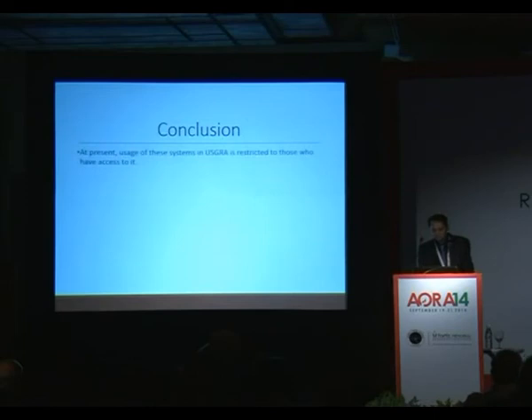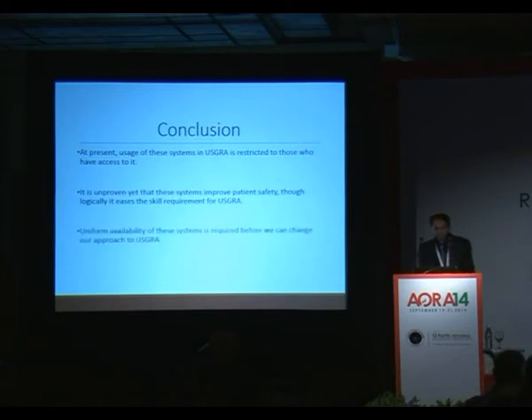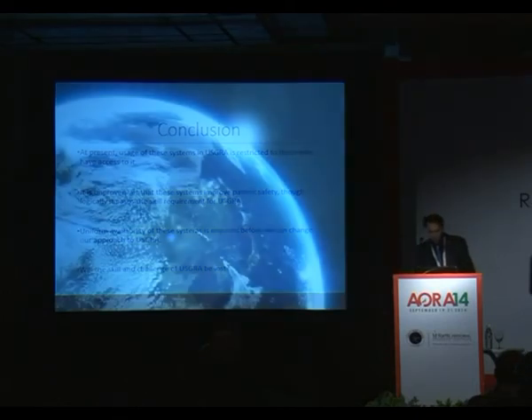In conclusion, it's restricted. Not many people have these machines, especially the GPS kind of machines. So unless everybody gets it, it's not going to get very important. It's unproven whether this actually improves patient safety. It's just there. Logically, it does look like that, but we still have to prove it. Again, do we change our concepts of anesthesia and regional anesthesia with these machines? And are we going to lose the skill and challenge? That's something we need to think about. Thank you.